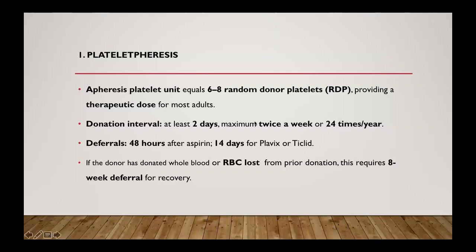Platelet apheresis is a unit that is collected by machine. Usually it is a large amount, compared to what we call random donor platelets. It is equal to 6 to 8 random donor platelets, providing a therapeutic dose for most adults. The donation interval between one donation and the other is at least 2 days, maximum twice a week, or 24 times per year. So that is the maximum number of times someone can donate platelets through apheresis.